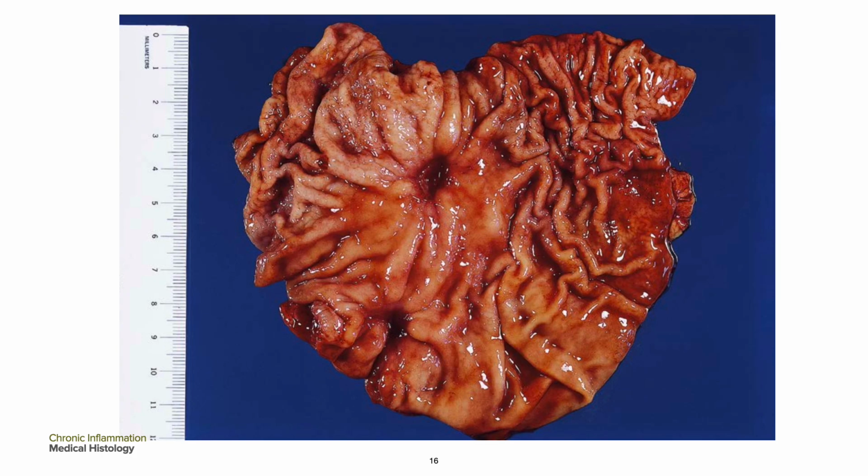This is chronic peptic ulcer. A partial gastrectomy was performed because of hematemesis. There was a bleeding artery in the base of the ulcer, as is shown in this image.